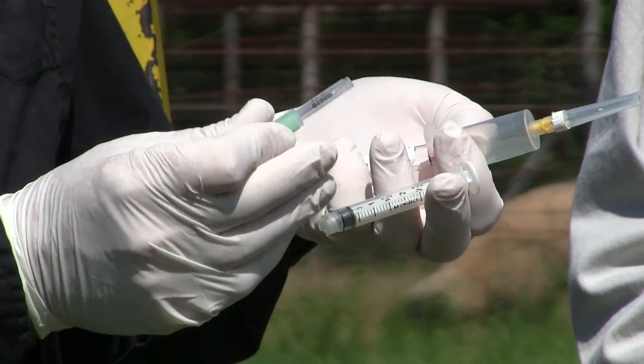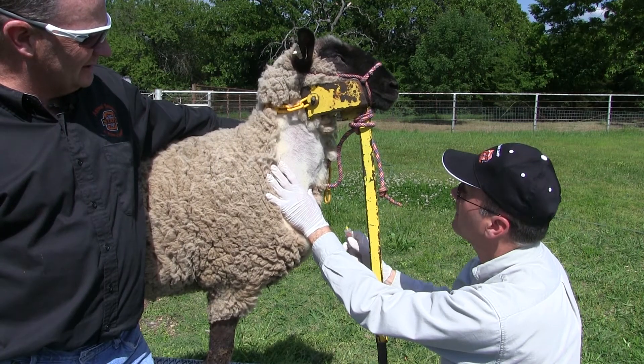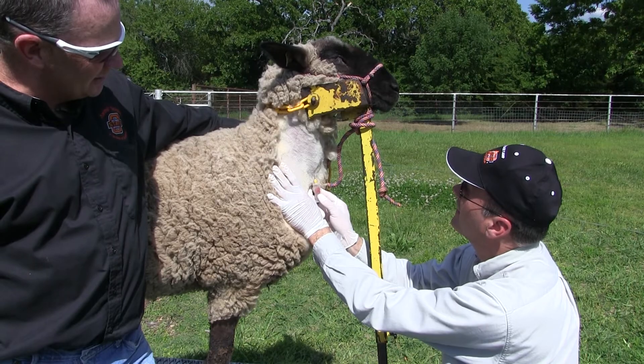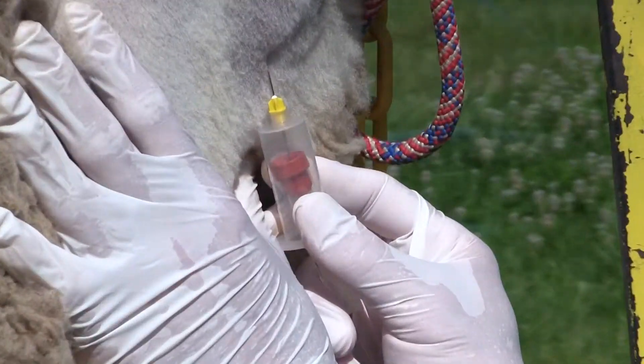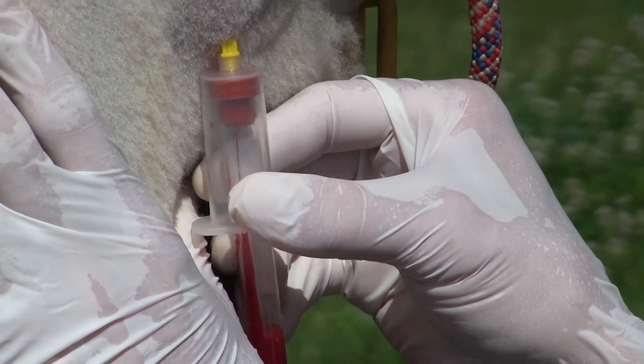He's putting pressure with his left hand and has the tube in his right hand. He found the vein — by putting pressure on it you can kind of see the blood being pumped through that vein. He's going to use that tube to pull the blood; the pressure in the tube is going to pull the blood right in.